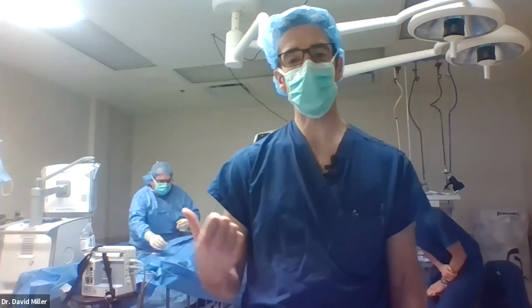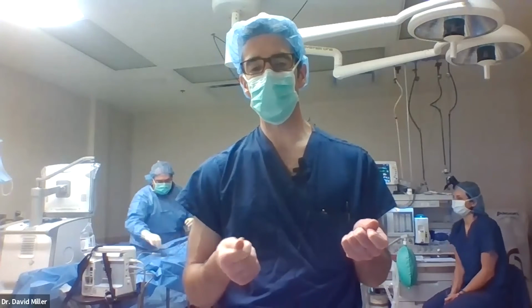Does the illumination help find the retinal tear? Absolutely. When you saw me struggling to find the retinal tear during the case, what we were doing, besides still depressing, is I was moving the light pipe in different positions and angles. So you don't want to just be static. You want to be kind of shifting and moving. And I'm a little fidgety anyhow, maybe a little hyper. So I'm always kind of looking, tweaking, and it's a two-handed maneuver. I'm trying to get different angles of light on that area of the retina to get a better view for these tiny tears.